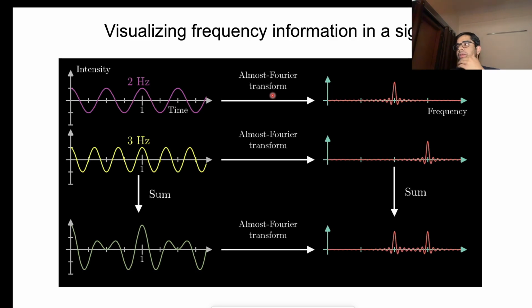It's an algorithm that is an approximation of a Fourier transform. Because of that physical implementation, we don't get a nice one line here, which you can never see because that is impractical. So in practice, whenever you're doing a Fourier transform, you generally see this type of a peak if you have a monotonic signal.